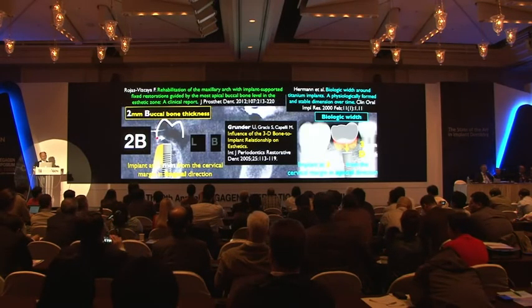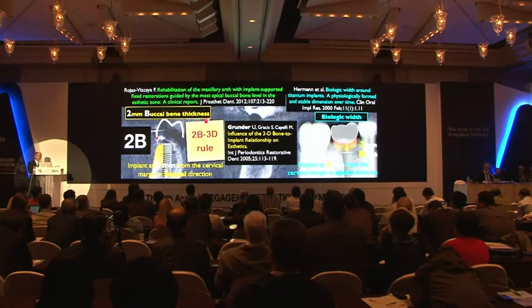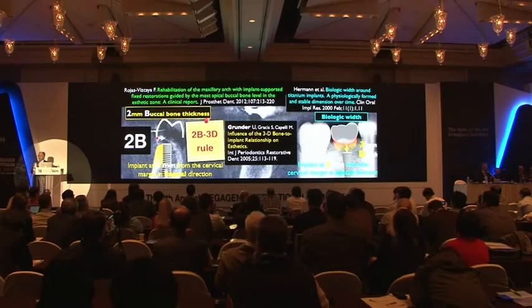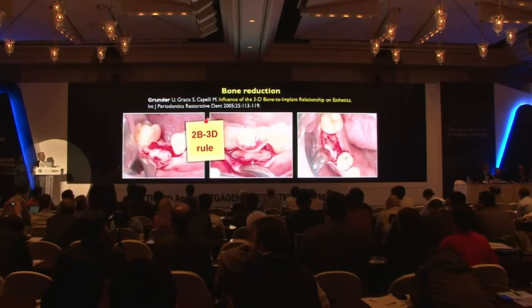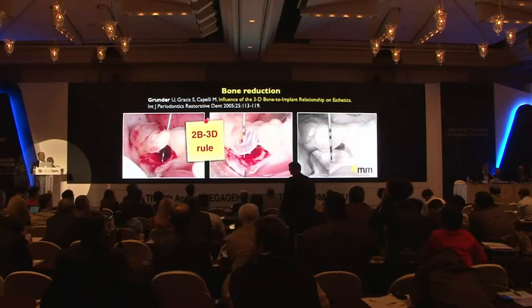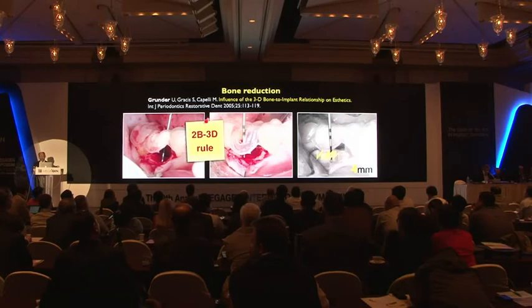Fernando Rojas-Vizcaya also executes this a lot. So we come up with 2 millimeter buccal thickness with 3 millimeter depth. That is the place we want to put our implant. So we go ahead and run through every procedure to make sure that we follow this basic rule. We use this simple surgical stent. We know from here we need to cut 4 millimeter of bone out.